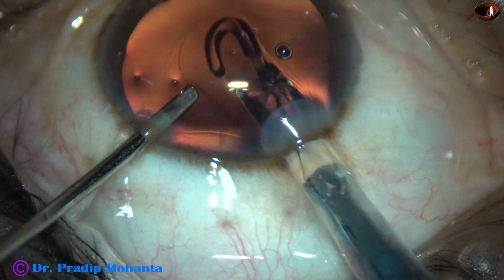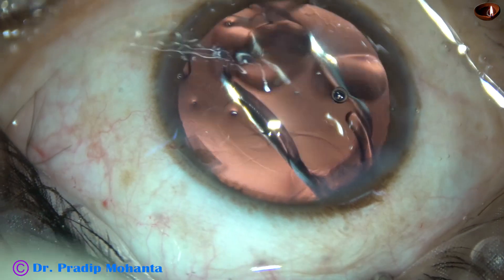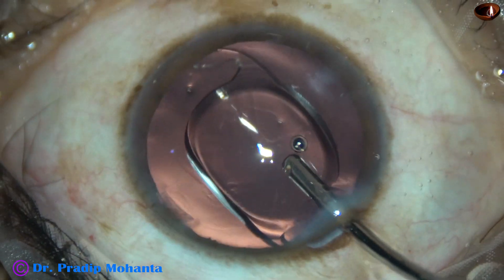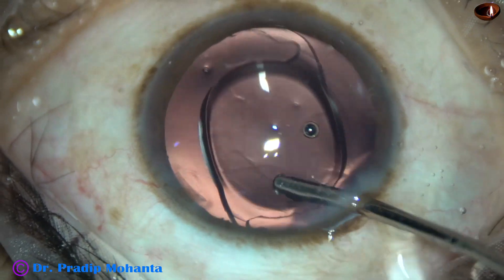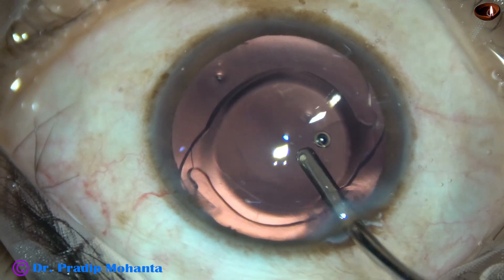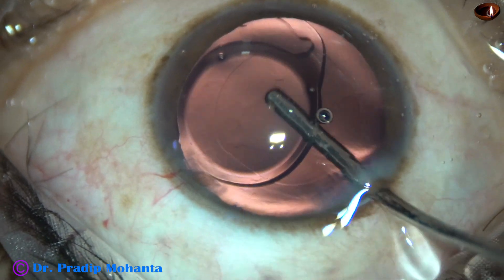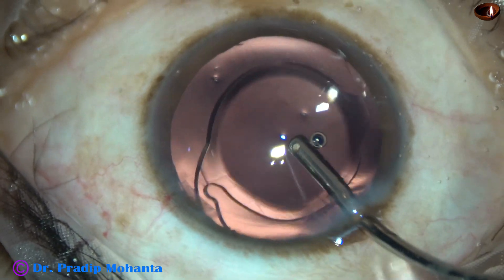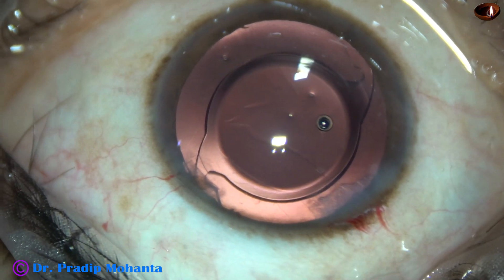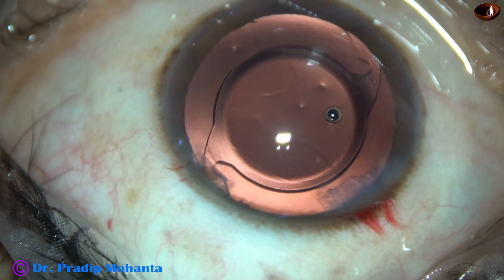This is a beautiful lens — my favorite lens — Tecnis One from Johnson & Johnson. It is a beautiful lens. If I opt for surgery of my own eyes, I will go for this lens. Multifocal? No. Toric? No. A beautiful monofocal lens, with the rest of the correction done by spectacle. This is my aim — for my own eyes — and most of the time I use this idea for my patients.